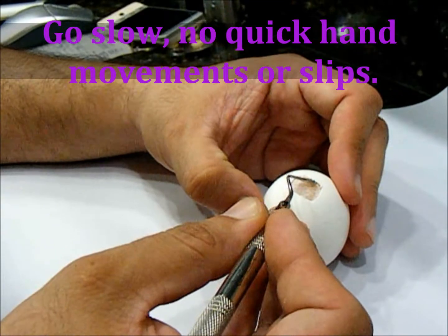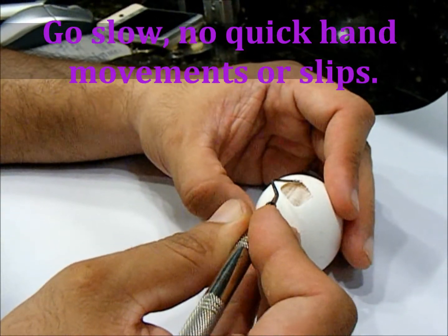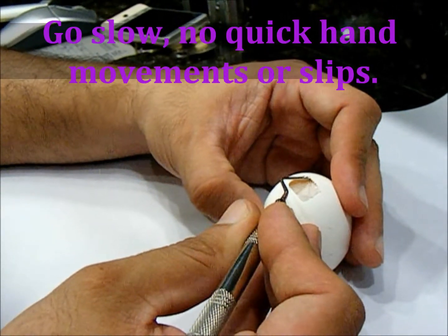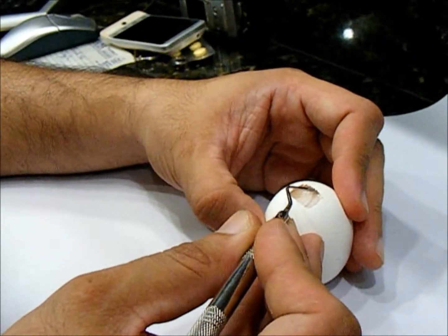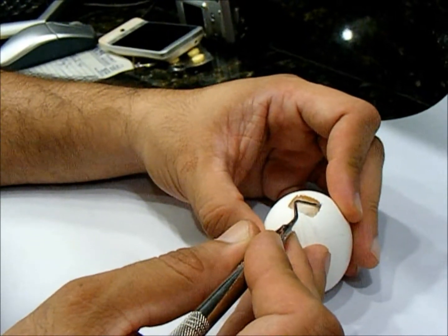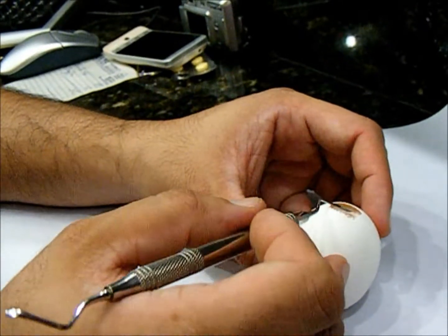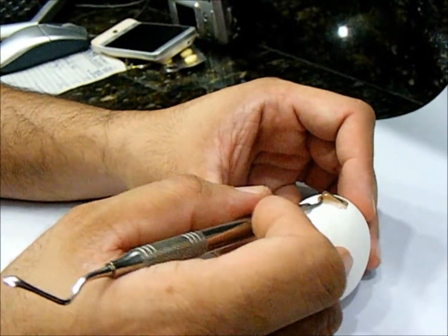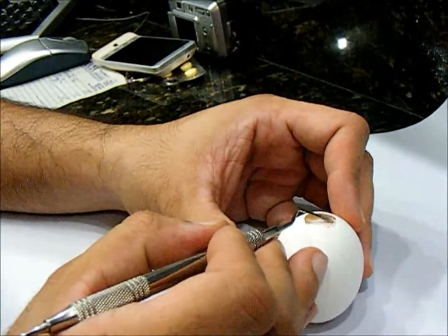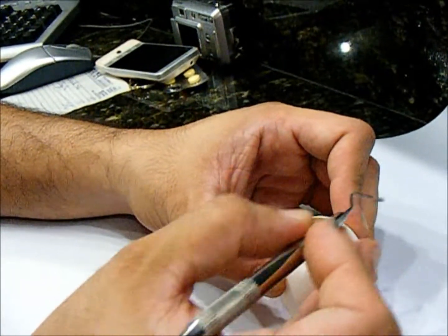The anatomy of the sinus is visible from the outside here, but the same principle still applies: you keep the flat end of your instrument towards the bone at all times, and the rounded part of the instrument helps you peel up. Looking inside, the sinus is nicely peeled away with no ruptures. I am constantly balancing my finger on the eggshell — you want to do the same inside the mouth so you don't have any slip of the instrument.